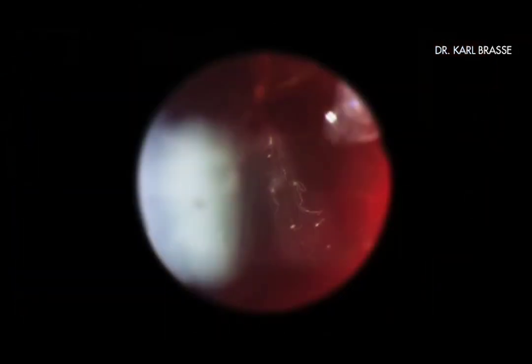Now we are going to talk about group 3 floaters. This group is unfortunately often very resistant to laser treatment. Those floaters are degenerative formations of the original framework of fine collagen fibrils. We find a huge variability of vitreous structures like cotton ball-like threads, clumps, clouds or bottlebrush formations. These are often just partially removable.